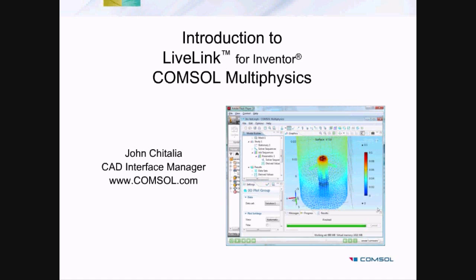For this demonstration, we will be examining a pacemaker electrode. We will look at how the geometry affects the total resistive power lost in the area surrounding the electrode. We will want to measure the resistive heating in watts as we change the geometry. We can then use LiveLink to adjust the dimension parameters and graph the calculated resistive heat.